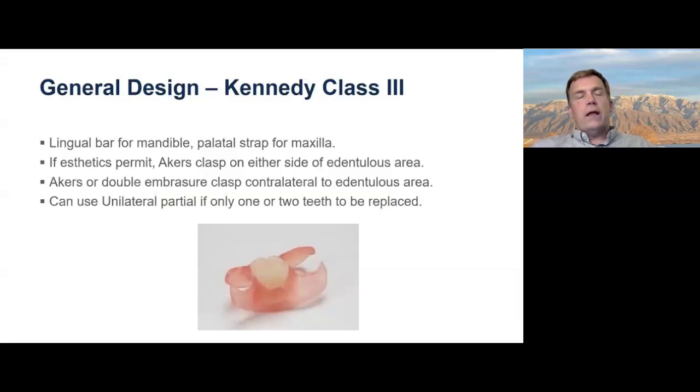One of the things we want to keep in mind when we talk to our patients about these is that unilateral partials can move buccal lingual as well as mesial distal a little bit. They're not going to be as stable as a full arch partial, but of course they cover much less of the mouth, and they can be quite comfortable, especially if flexible like this. So again, preoperative communication is very important, talking with the patient about the pluses and minuses of a different design.